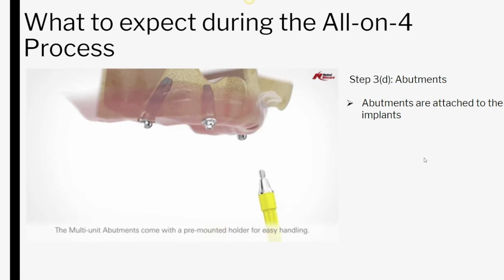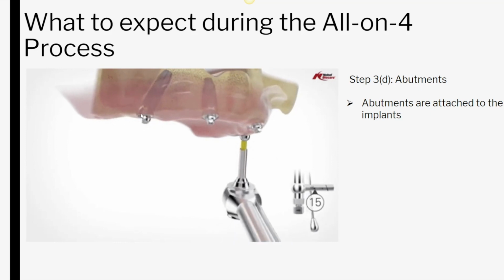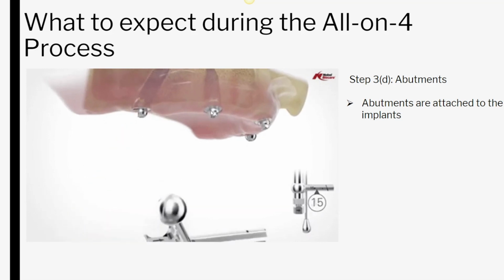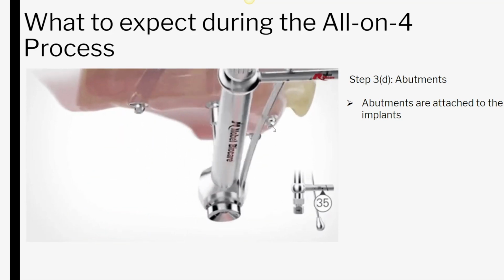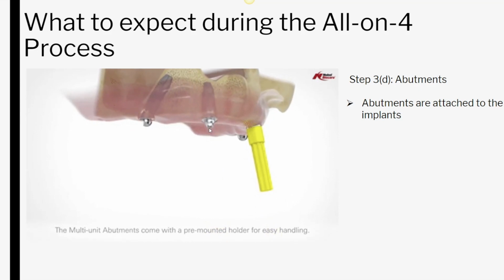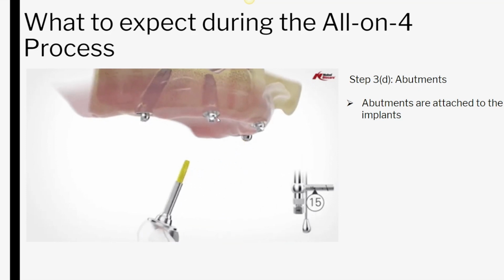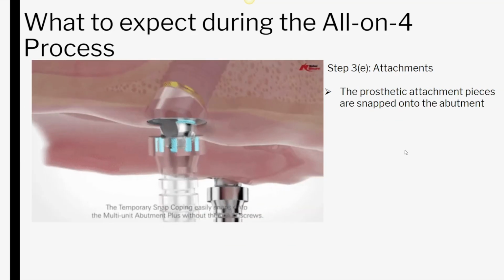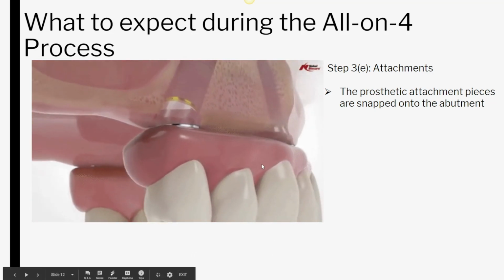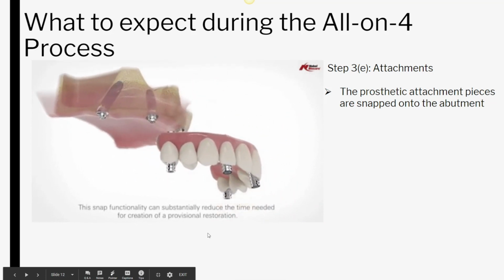So after we place the dental implants, what we're going to do is attach the multi-unit abutments. These are basically the pieces that go in on top of the implants that are going to be protruding through your gums. So that is what you see being tightened in this process. Again, these are the multi-unit abutments that go in on top of the implants and protrude through your gums so that the cylinders have something to grab onto. This is the attachment of the cylinders through which your prosthesis goes on top. Again, the prosthesis is what looks like your gums and teeth going in on top.